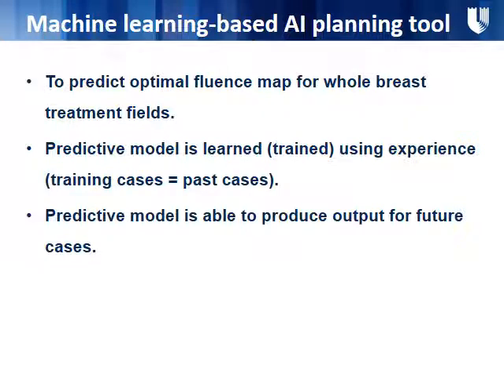Our AI planning tool was developed based on machine learning technique. It predicts the optimal fluence map for the whole breast treatment field. And the predictive model is learned using past training cases, and it produces output for future cases.